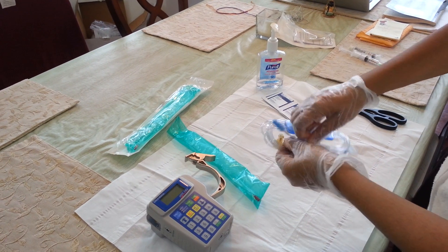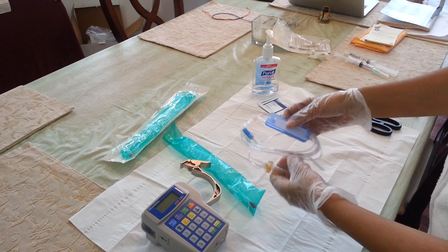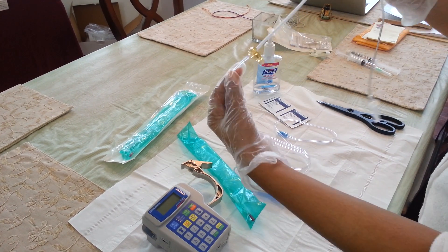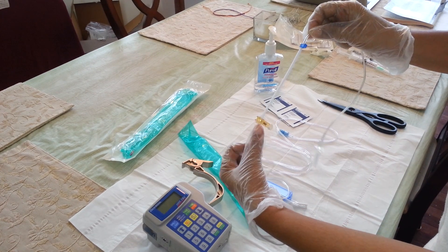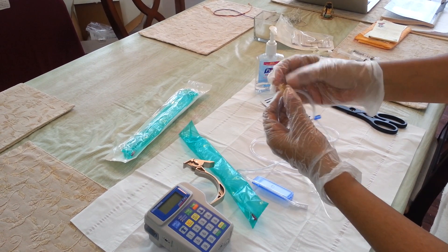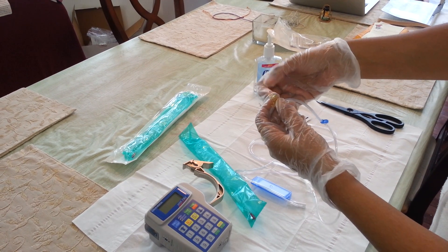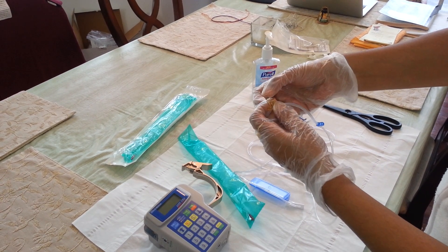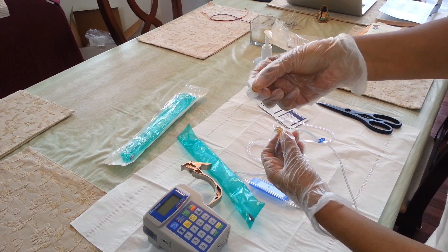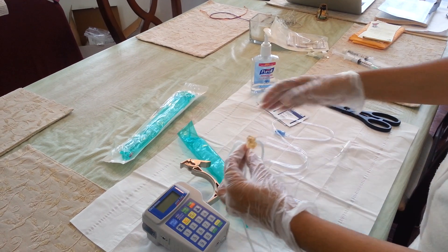I am going to remove the extra taping and discard it. Now as you can see, this is the yellow part. On the yellow part on the top is a small circular tip that needs to be broken. I am going to apply slight pressure — and that is all it takes for this to come out. I am going to discard this. Now the tubing is ready to go into the pump.